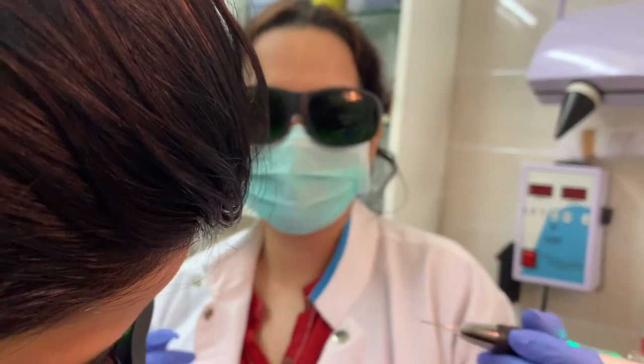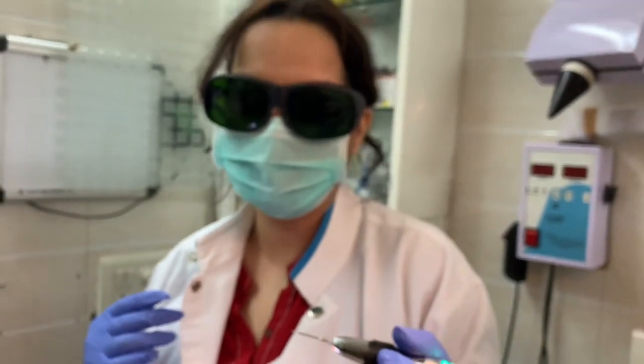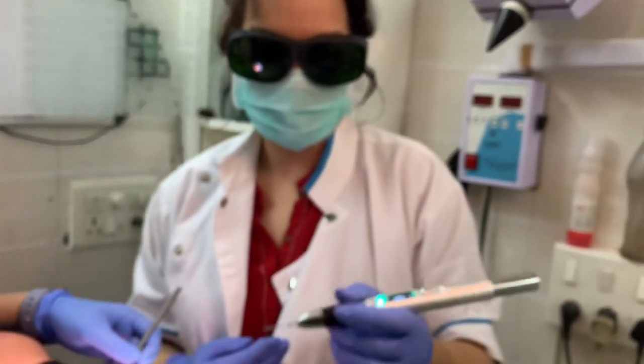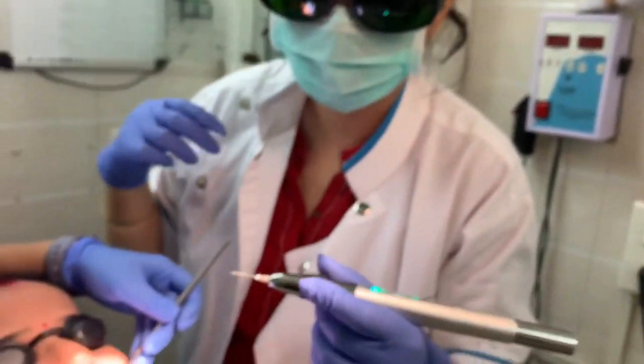Hi friends. We are using this low level laser on patient. Right now we are doing crown lengthening. So just see what we are doing right now.